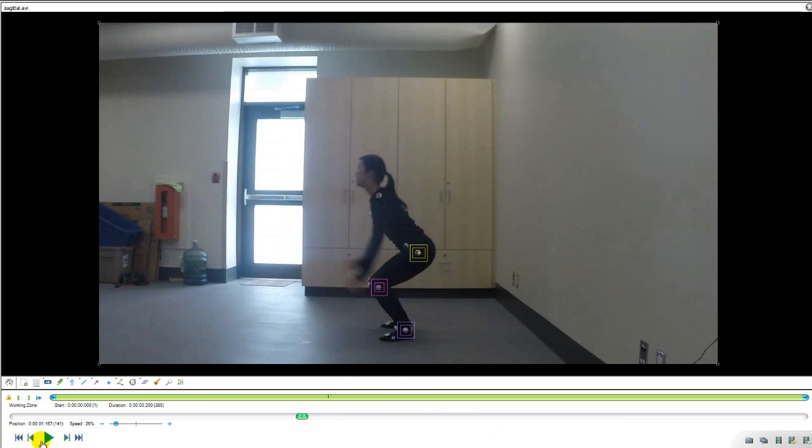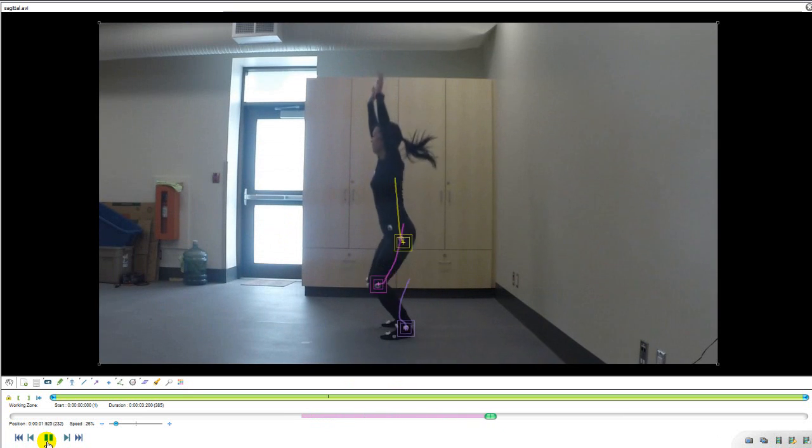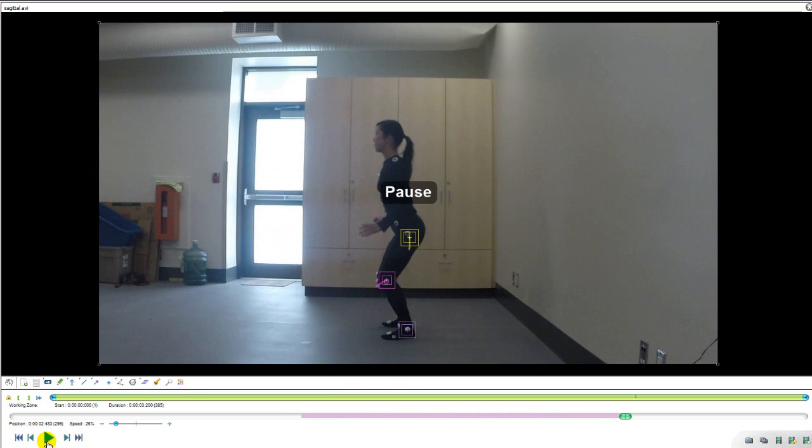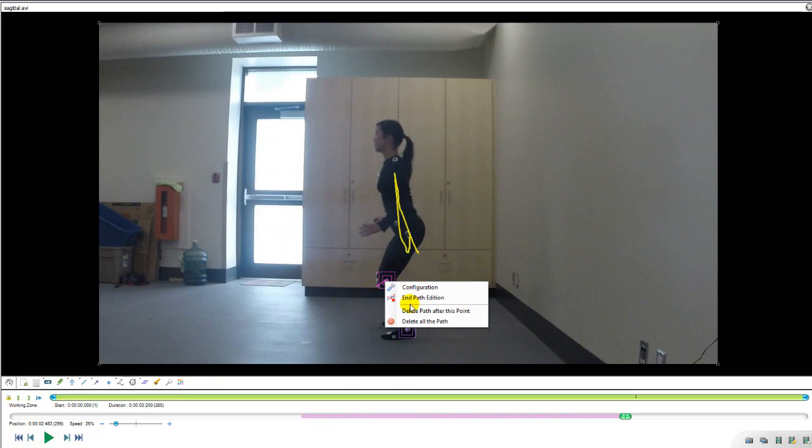Once all of the tracking is set, play through the movement until you reach the frame that you would like to stop tracking. Then right click on each tracking point and select End Path Edition.